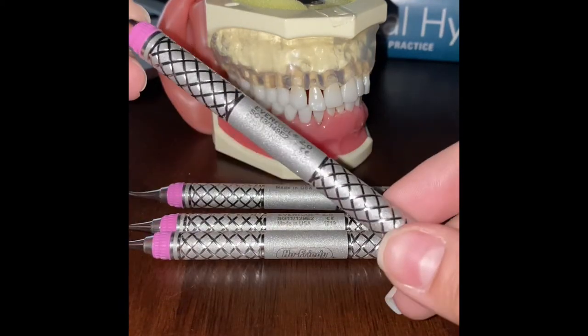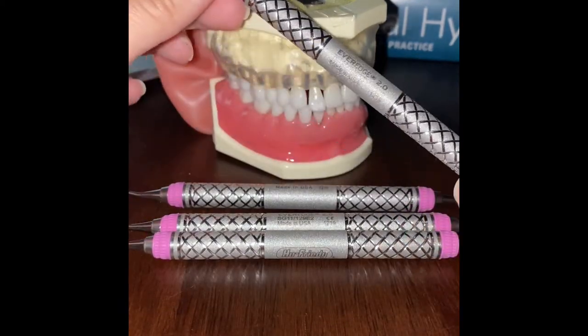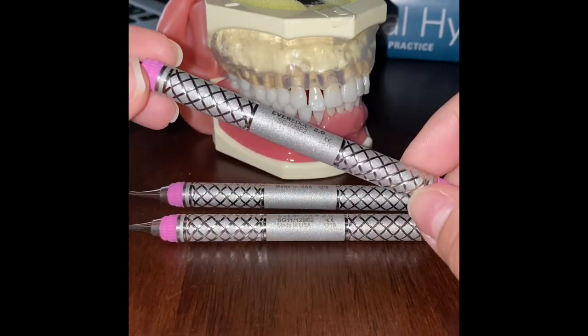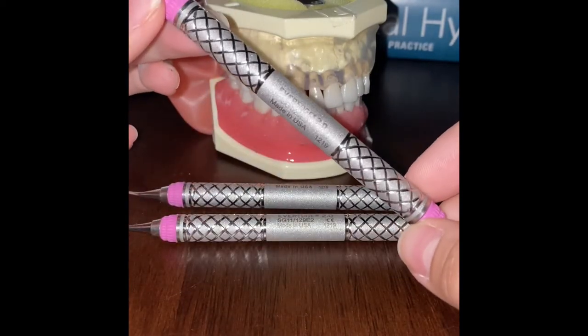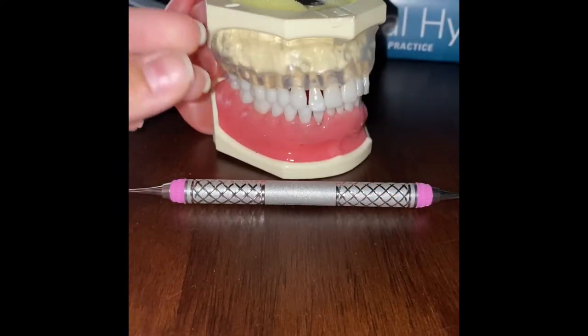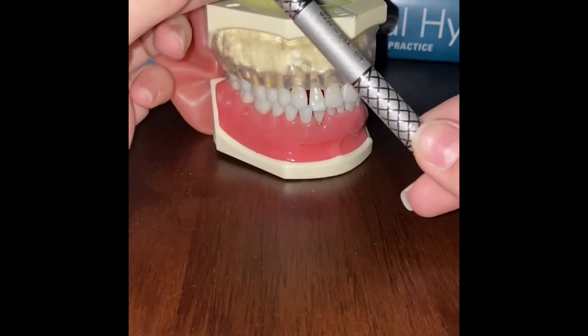Today we'll be looking at the Universal 1314 curette and the Gracie curettes — specifically the Gracie 1-2 curette, the Gracie 11-12 curette, and the Gracie 13-14.